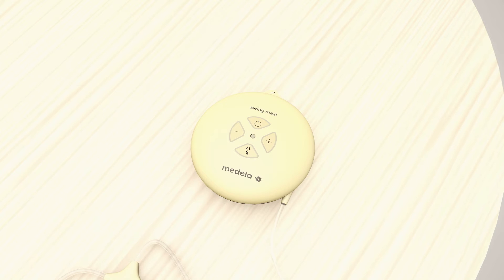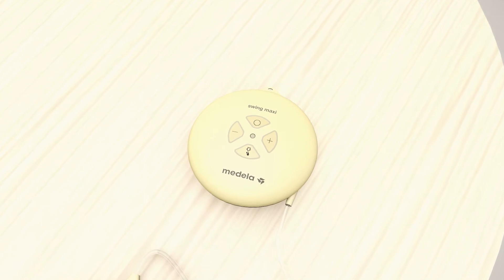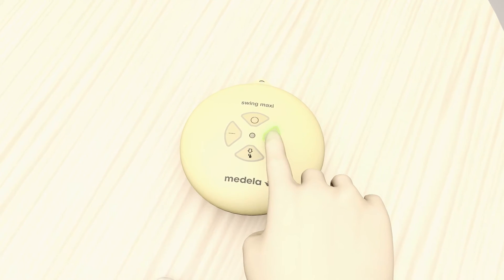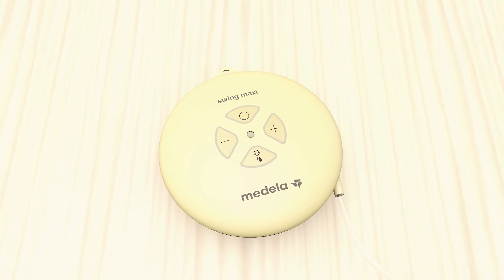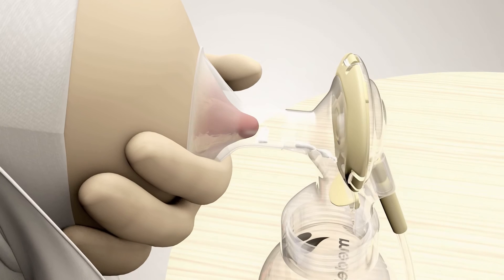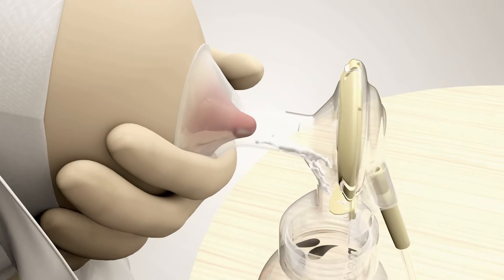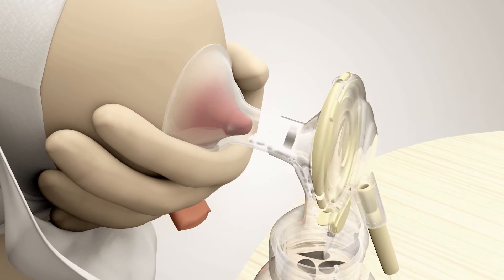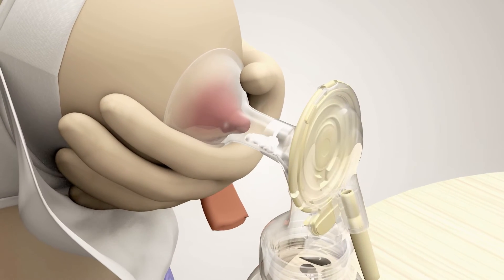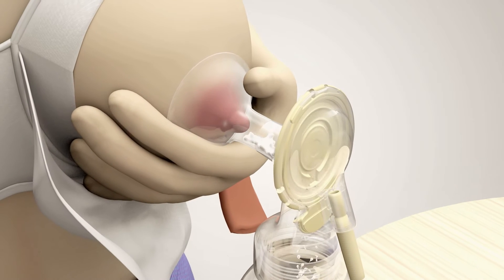Research has shown that using your maximum comfortable vacuum will get more milk in less time. The optimal level is as high as possible, but you still feel comfortable. You can easily adjust the vacuum during the pumping session at any time. A pumping session should always last as long as the milk flows — usually 15 minutes or more.